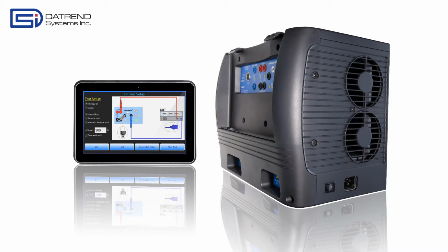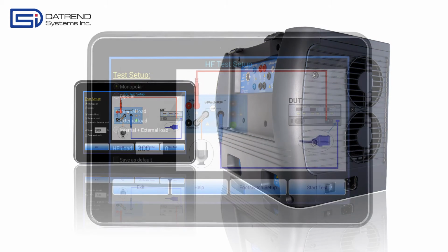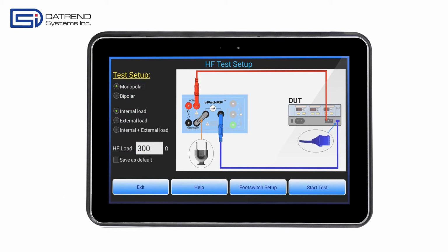vPad-RF is a test instrument intended for measuring the output of electrosurgical generators, which are also known as Electrosurgical Units, or ESUs. vPad-RF includes an RF analyzer and a 10-inch tablet computer which has a number of software applications or apps installed on it.